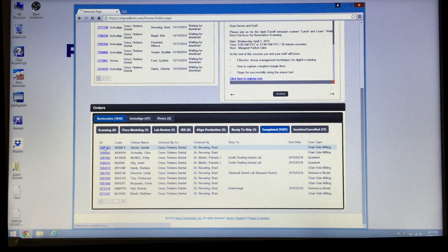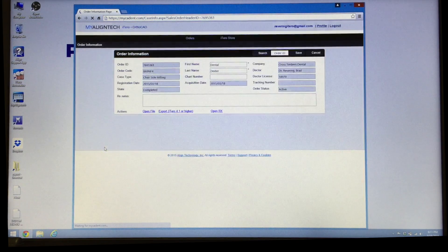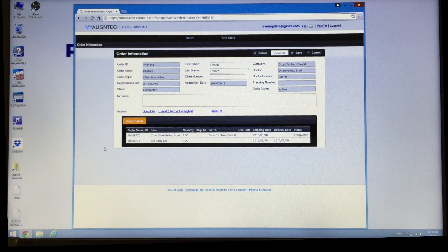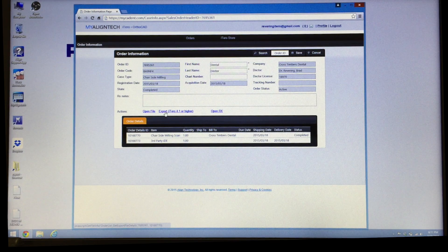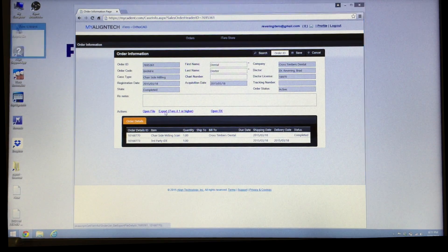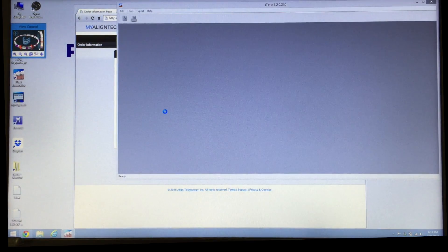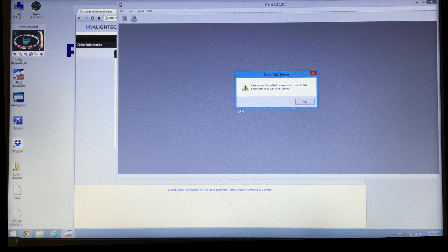Let's click on that ID number and it will take a moment to pull up the page for that case. We're going to select export iTero 4.1 or higher, so click on export.